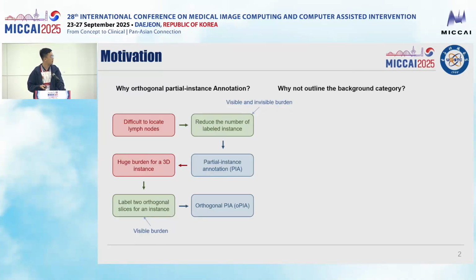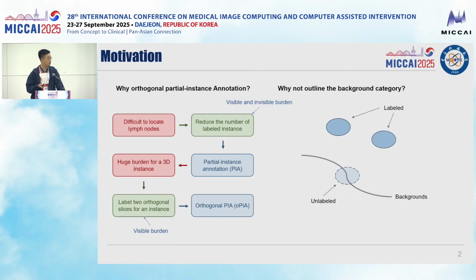So there's still a problem: why do we not annotate one more class, the background class? Because for multi-region objects, some instances are unlabeled.